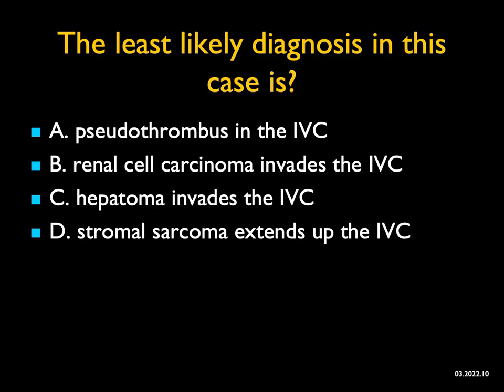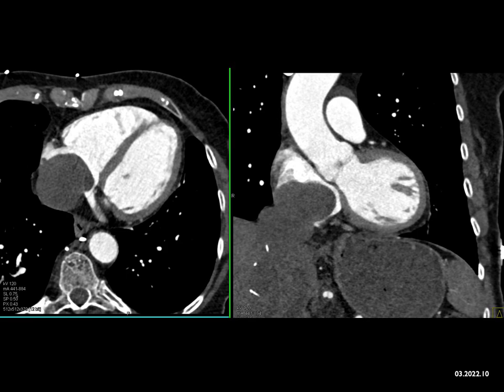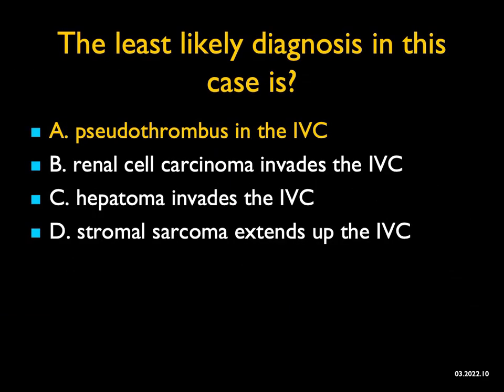The least likely diagnosis in this case — you see a large filling defect in the patient's IVC and the right atrium, coming from beneath the diaphragm in all likelihood — and in fact that's where it came from. What is the least likely diagnosis? There's no way it is a pseudothrombus; this is the real thing. You want to argue whether it's from a renal cell carcinoma, adrenal carcinoma, hepatoma, or endometrial stromal sarcoma — which indeed this was. You could argue it's a tumor arising in the right atrium growing downward, but I feel that's less likely. Pseudothrombi are usually flow-related. This is not a pseudothrombus — this is the real thing, the mass effect. In fact, it was an endometrial stromal sarcoma extending up into the IVC, recurring after many years.